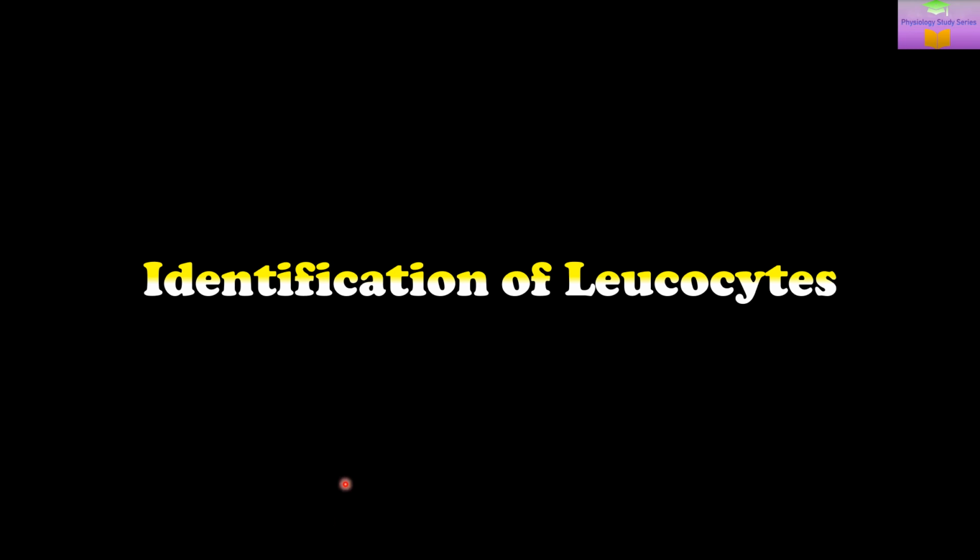Hi all, in the Physiology study series on practical physiology, the topic for today is identification of leukocytes in a blood smear.